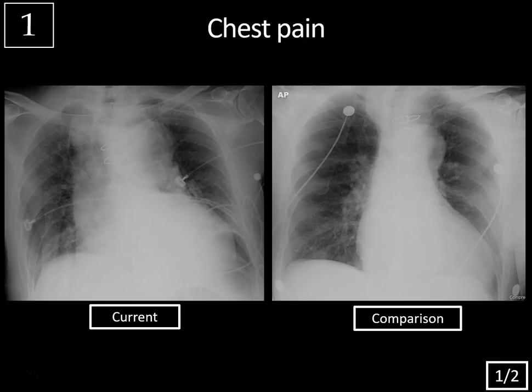We're looking at two AP portable chest x-rays and compared to the prior study, you can see there's been significant widening of the mediastinum. You get some normal widening of the mediastinum on a portable chest x-ray, especially at low lung volumes, but comparing these two studies, this is a pretty dramatic increase. Generally, you can use a rough measurement of greater than 8 centimeters on transverse dimension as a definition for a widened mediastinum.